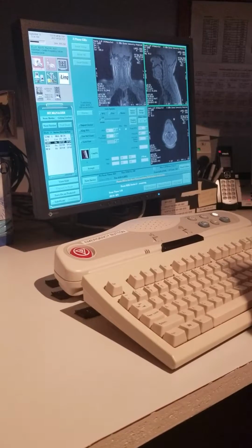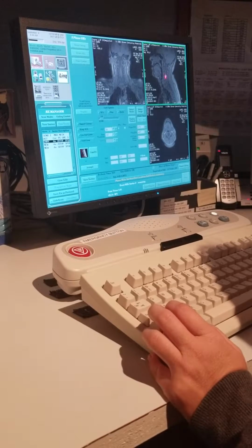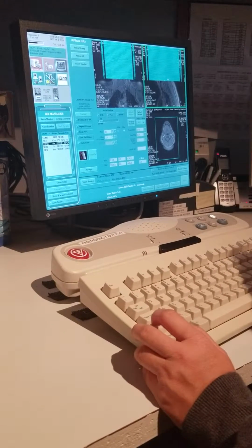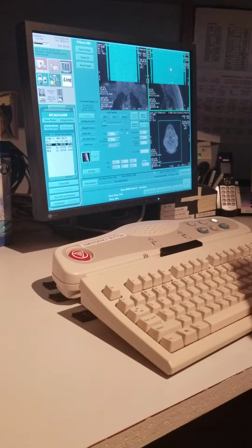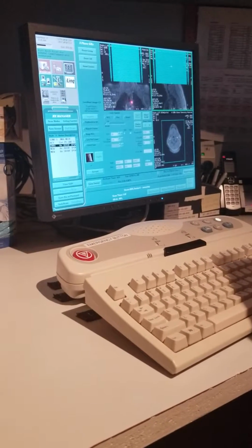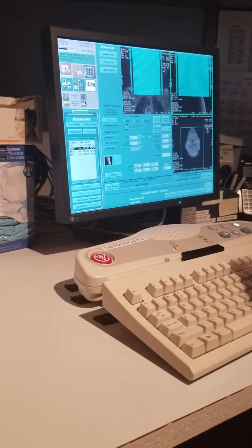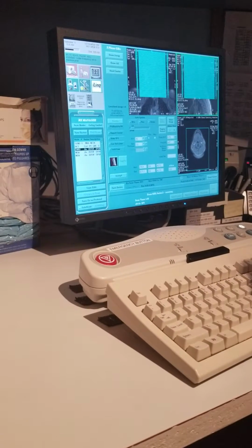So go ahead and graph it, and then just go ahead and shift click in the middle. We're about 3/4 is about where the bifurcation is, so it's somewhere around there. And then you'll get your slices. So it's not a 3D acquisition where it's got volume boxes. These are just individual slices. As you bring it down, remember this is where your arch is. So bring it down, go right to the arch.